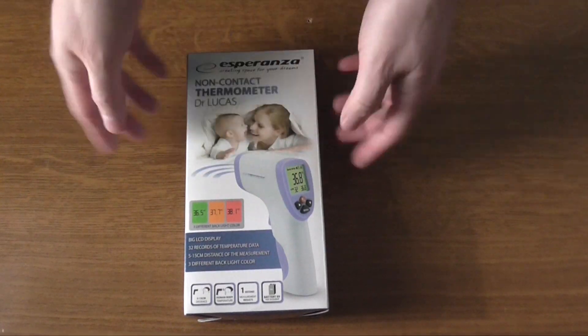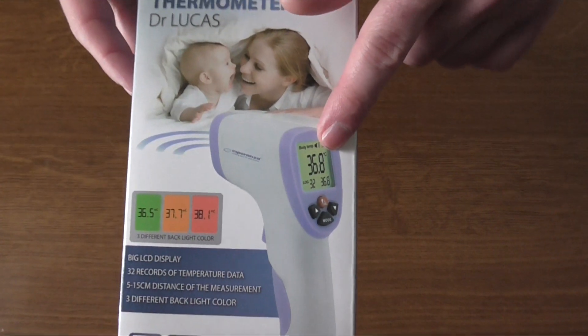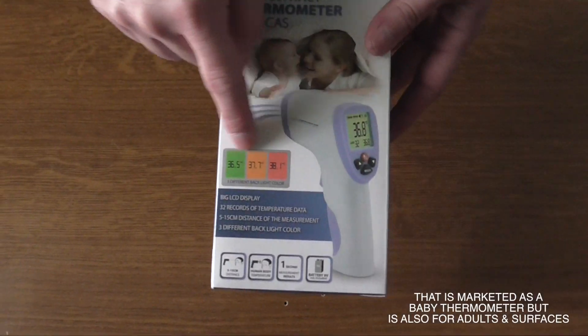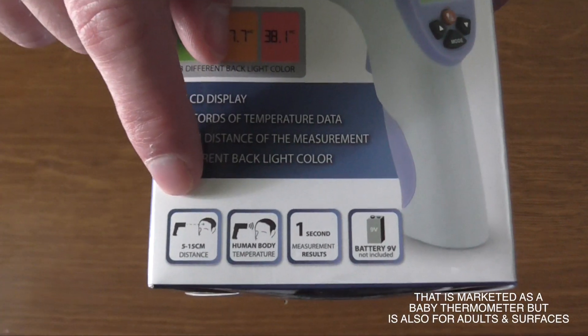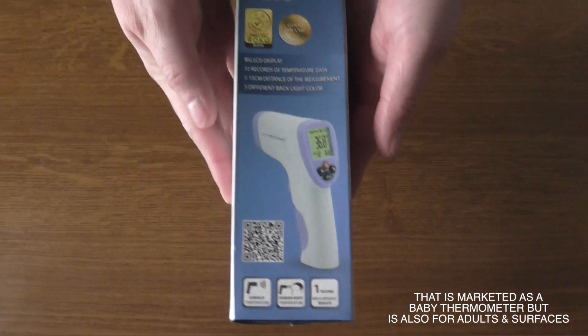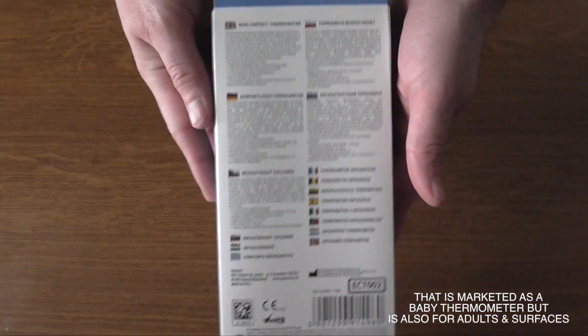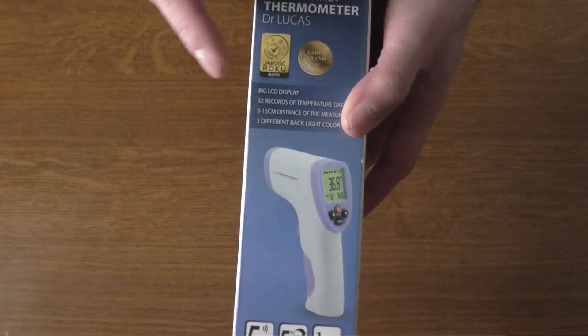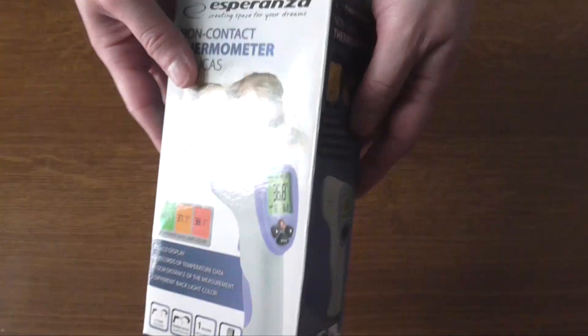Hello YouTube, Dion from Antextech. Here we have the non-contact thermometer from Esperanza called Dr. Lucas. It has a three-color indication for temperature that can be measured from a short distance in one second, and you only need one battery. This is a time we really need a gadget like this that can give you an instant measurement for fever or body temperature.